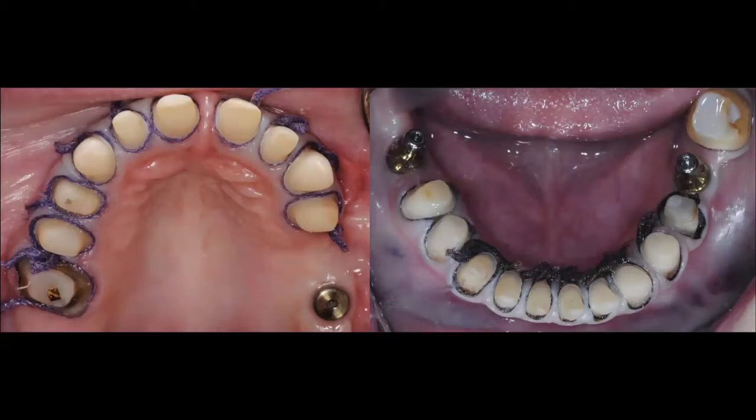So we have our very opaque, very strong zirconias, the ones that we've been using for the longest time, that have a 3 mole yttrium content that makes them very strong and very opaque. I don't want to get into the chemistry, but I do want you to understand that these numbers that go right next to the mole number, the yttrium content percentage of each of your zirconia substrates, the difference between these numbers has a lot to do with the translucency of the actual zirconia restoration.